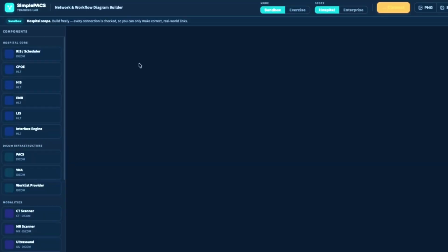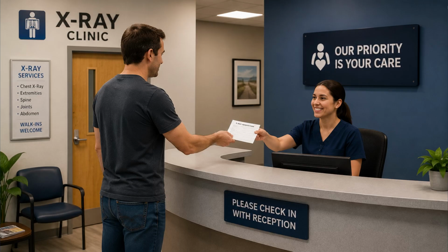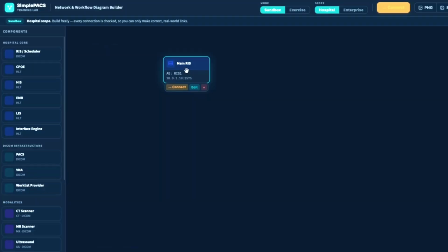Okay, so as a patient walks into a clinic, they would have a requisition, probably handed to them by their family physician, which actually is the document that authorizes the clinic to actually do the test itself. So that's fine. Now, what's going to happen is that they're going to walk into that clinic and go over and talk to the receptionist first. Now, that receptionist is going to take their requisition and enter this in their radiology information system. And that is how we're going to get this order digitized.